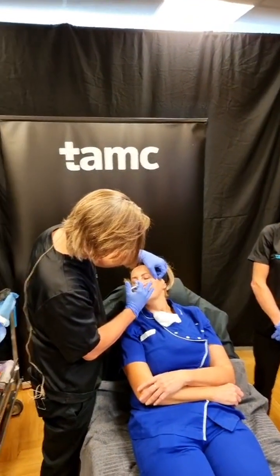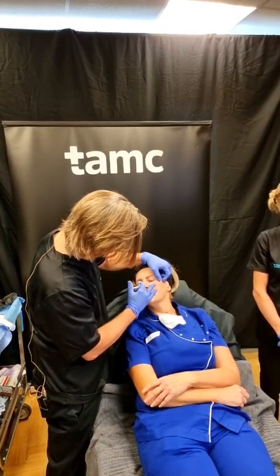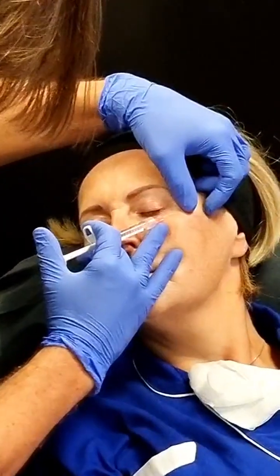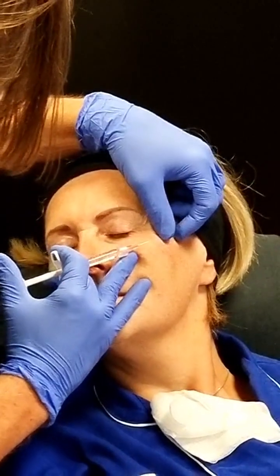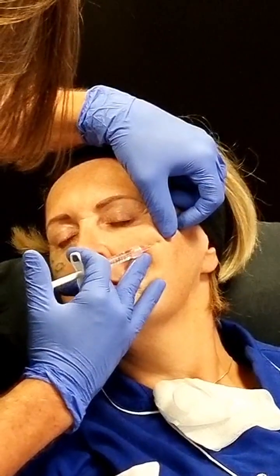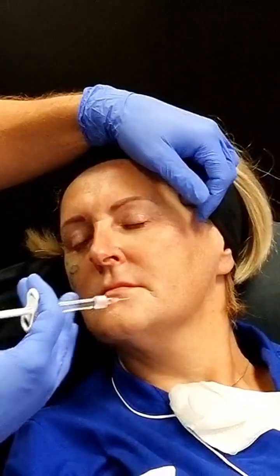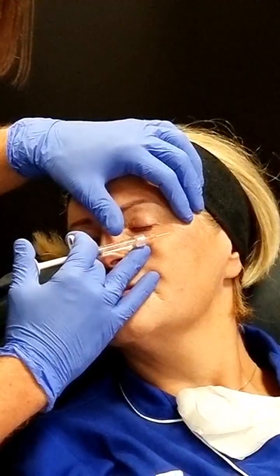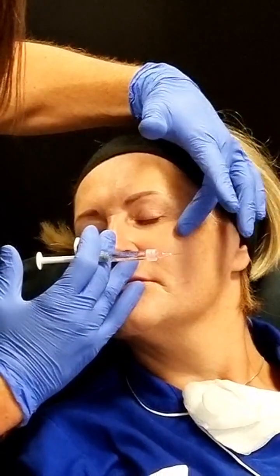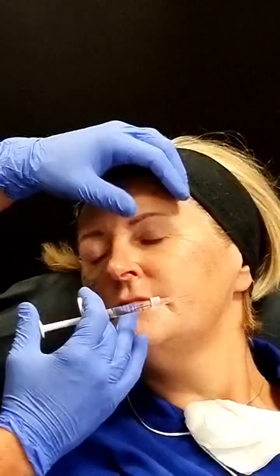This is a high G prime Nasha, and it's one of the oldest hyaluronic acids, so it's a gold standard in the industry. Some people might find it old-fashioned, but it's old-fashioned like a brick. We still use bricks, right? The safety profile is excellent. What I need is a hyaluronic acid that's really strong, that really will stick where I put it. And this is almost crumbly. You can see if you put it under the skin and play with it, it's like Hamasundaram said, almost like couscous or rice.